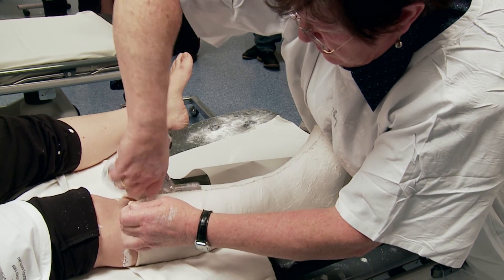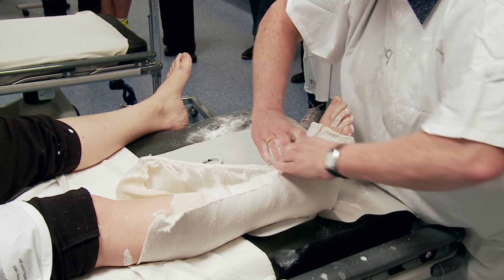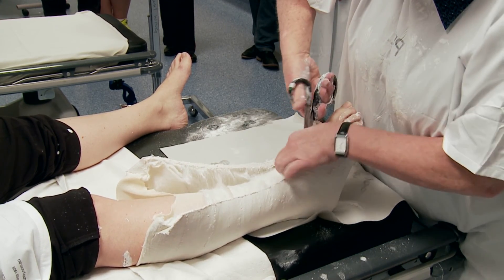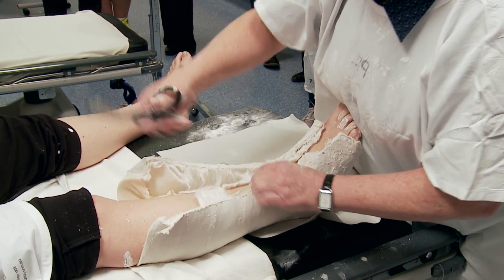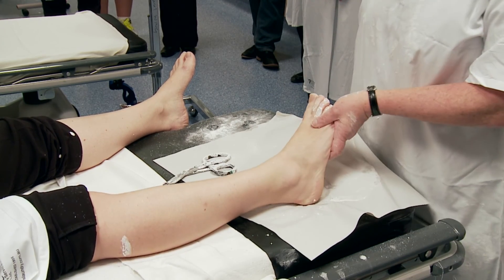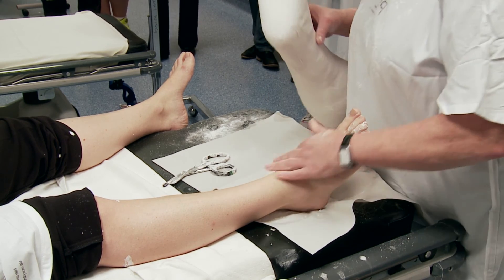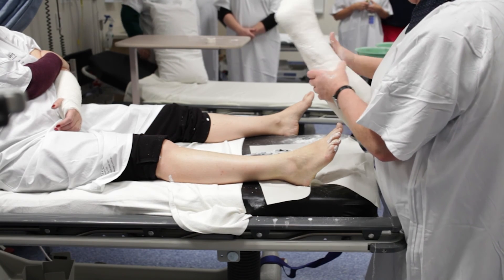Your equipment is important — you've got good scissors and spreaders, and it just spreads like that. Cut your stocking. Get the patient to lift the leg out. Make sure there's no pressure area, no sores, no blisters. Sometimes the hot plaster will cause a blister, and when you take the plaster off after four weeks you'll see it's all red. That's just because of the heat of the plaster.